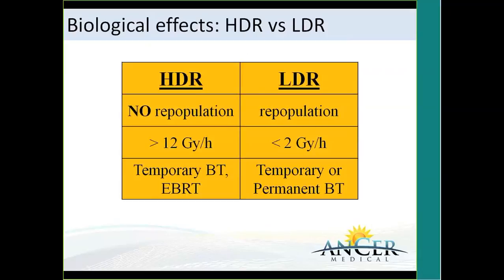No, HDR means the rate at which radiation is delivered, and if that rate is high enough to be comparable with the rate of proliferation, then this is considered HDR. It can be delivered with any type of radiation. In fact, treatments with LINACs or with protons are also HDR treatments, and that's why we fractionate them.